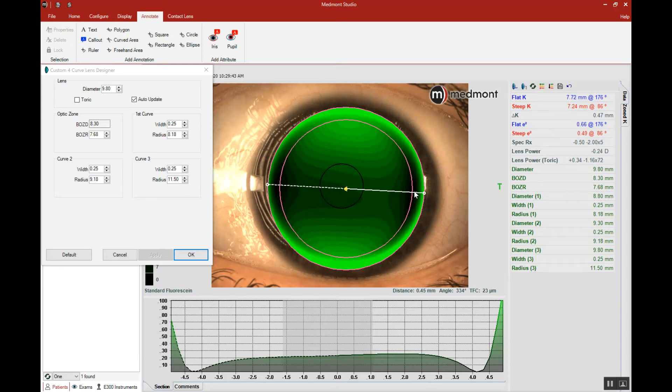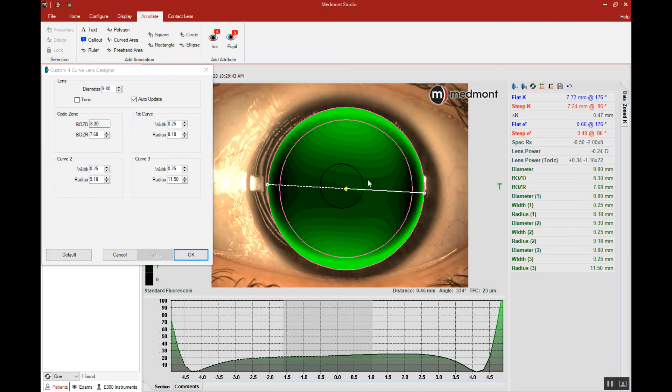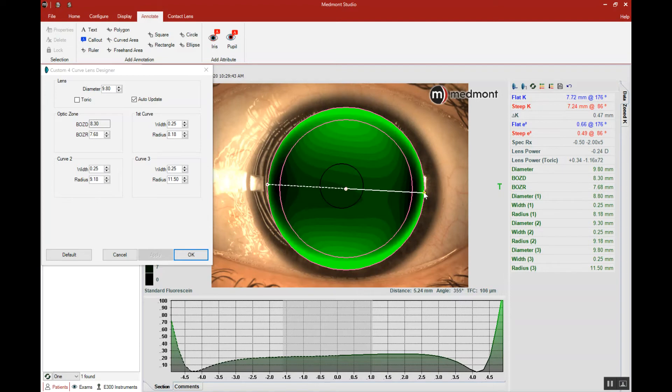So we have a good construction, an appropriate lens to cornea relationship across the flat meridian where the lens clears the corneal apex, lands in the mid periphery. That should keep it laterally stable. So the next question is how does the opposing meridian look?